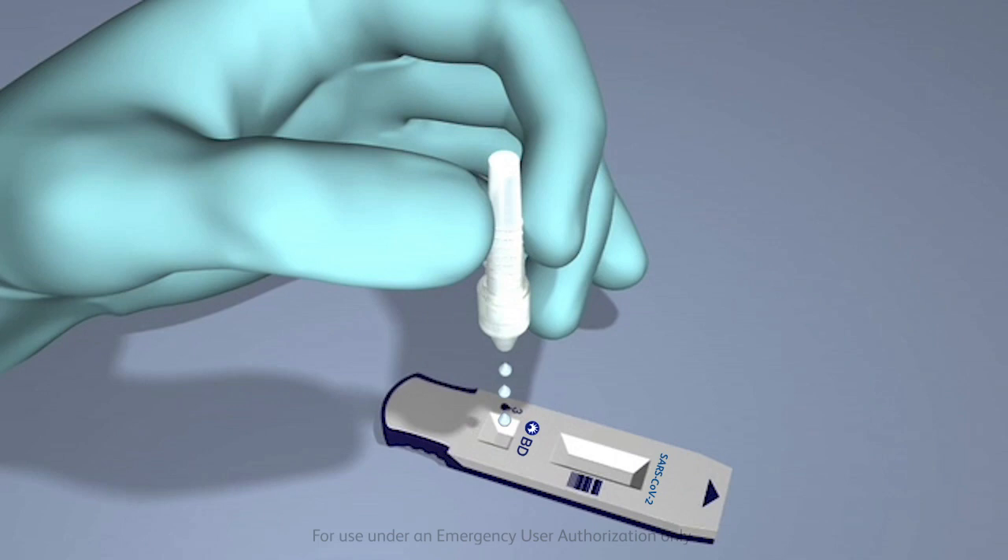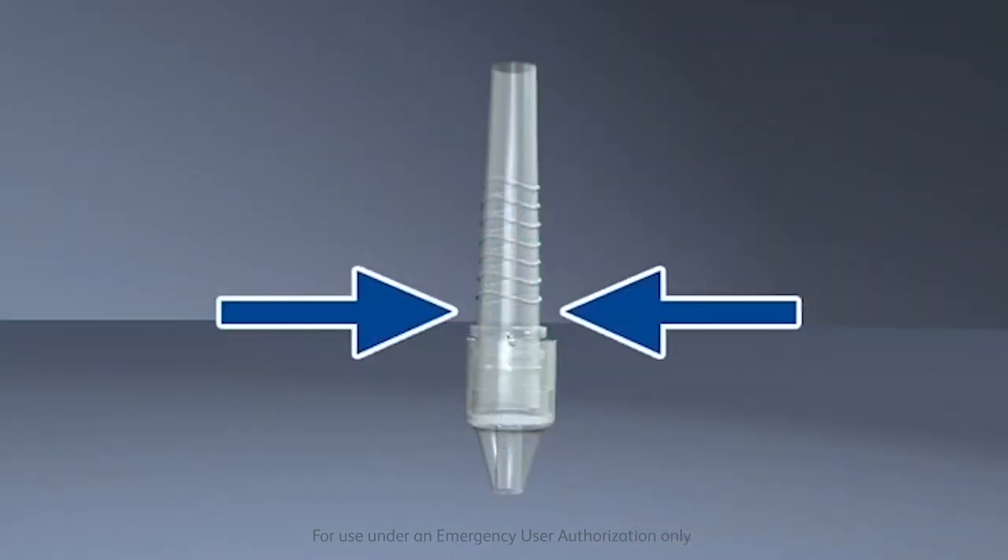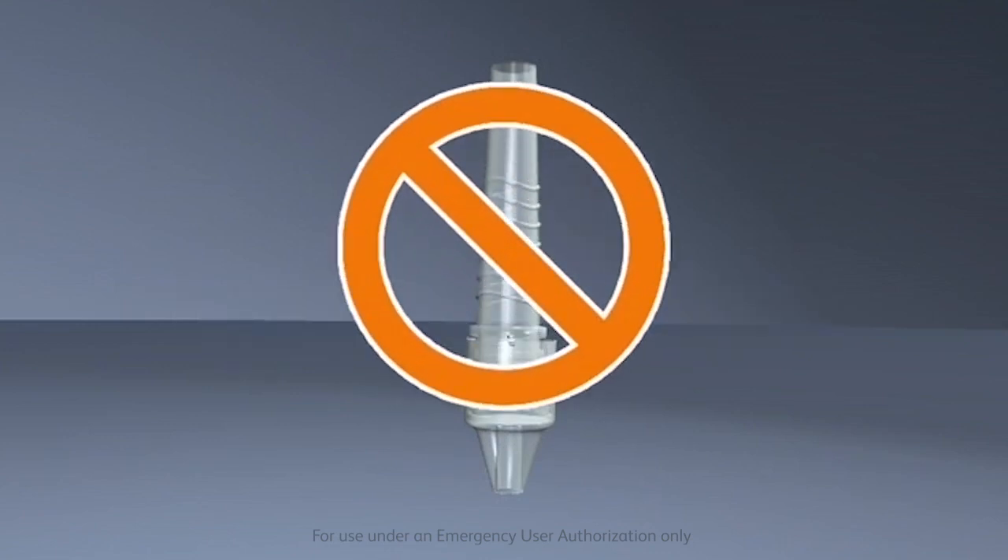Ensure that full drops are released, not partial drops with bubbles. Note that squeezing the tube too close to the tip may cause the tip to eject and the contents to leak from the tube.